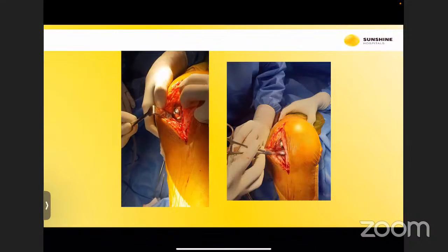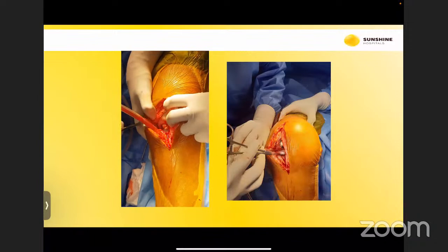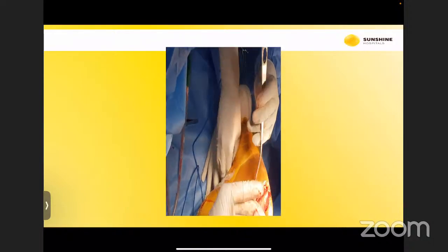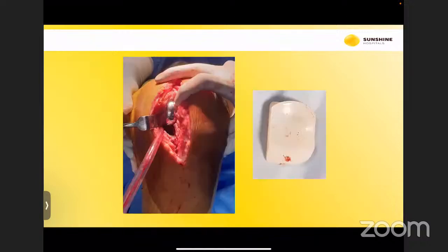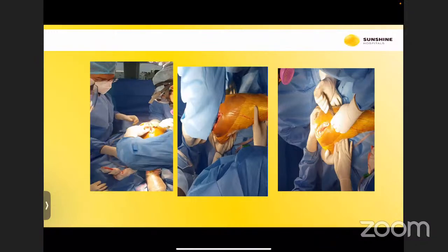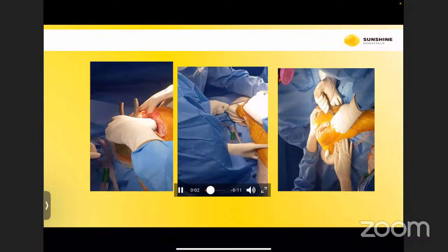So probably either the poly we put in initially was too thin, or her ligaments are stretched out, or something happened in due course of time that made her joint more lax and caused the poly spin out. So we pulled out the poly. It is easily coming out. And to form a space, you need to check whether everything else is fine, the ligaments are okay, and the implants are still well fixed. So we went with a thicker poly. We placed in a thicker poly. We went as high as we could go to see which gives the best stability.